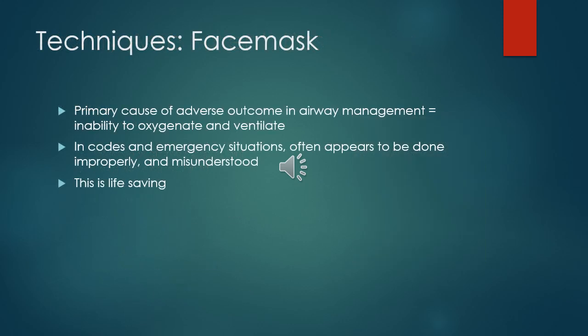Far and away, the most important airway management technique is the ability to mask ventilate. The primary cause of adverse outcomes is the inability to oxygenate and ventilate. In codes and especially emergency situations, it's often not optimized and sometimes misunderstood by those attempting to administer it. This is life-saving, and this is an area where you may be able to contribute very positively even very early on when you're on off-service rotations.